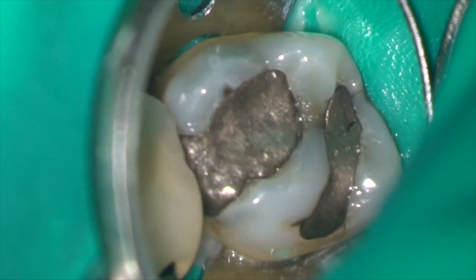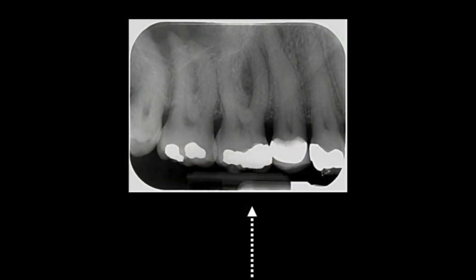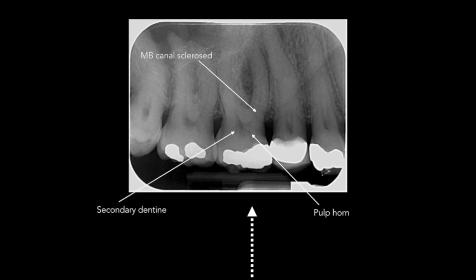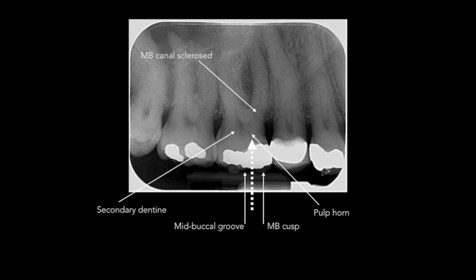Under the microscope you can see that I've isolated the tooth with rubber dam and this is the amalgam restoration. In this case I actually treated the maxillary right first molar and second premolar simultaneously. Similar to the last case there's reactive dentine in the pulp chamber and the root canals are sclerosed. I'm looking for a reference point that I can use to direct me in the direction of the pulp chamber when I'm making my access cavity.